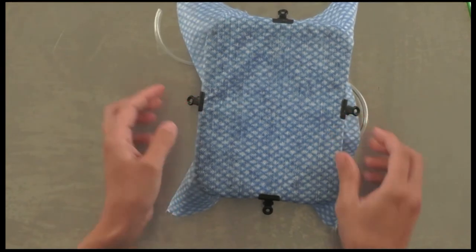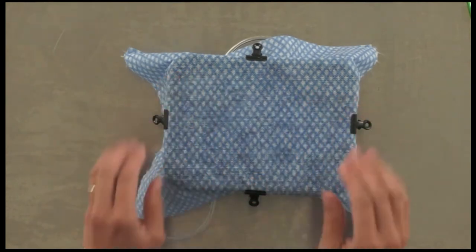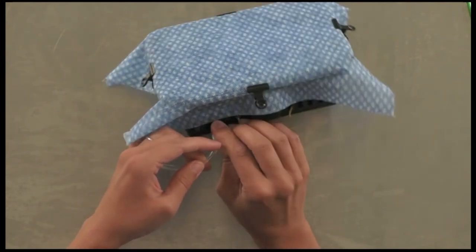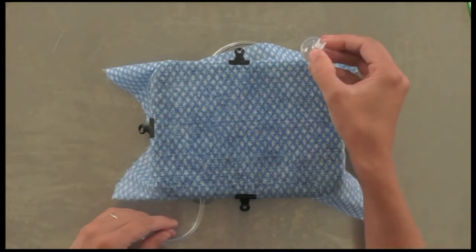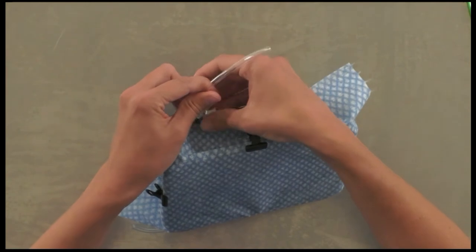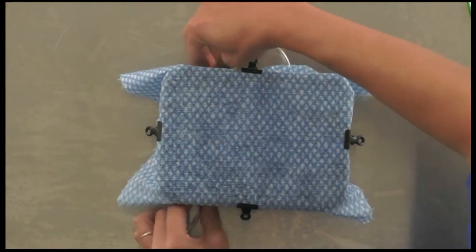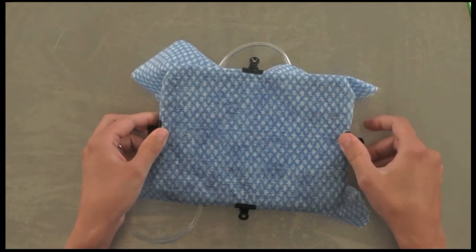Turn the tray so that the cranial aspect is toward your non-dominant hand, because that's what would happen in real life. Attach the binder clips to the IV tubing and suction cups so you can stick the basket to the table you're working on. Alternatively, you could just hold it in your lap — it just gives you something to pull against.